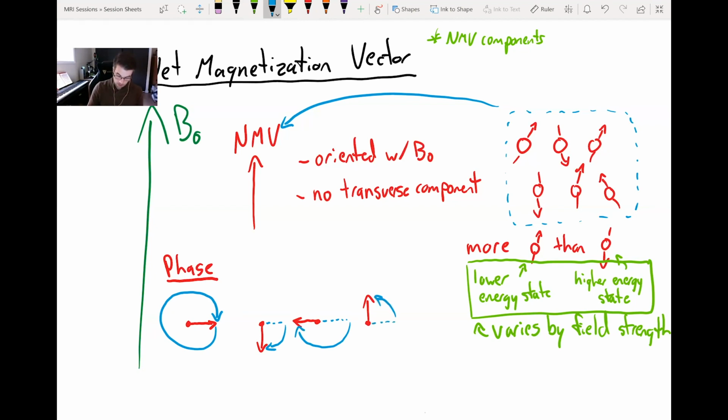This one's going to go in the opposite direction. Okay, so I've got three different phases here, or like three different steps in that cycle, right? So the first one here, just to give you guys an idea, and we're going to ask you for the values of the other two.